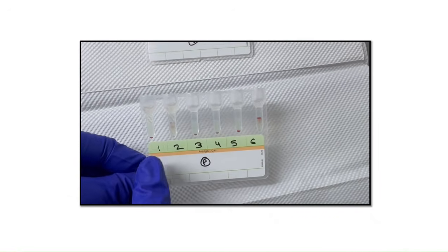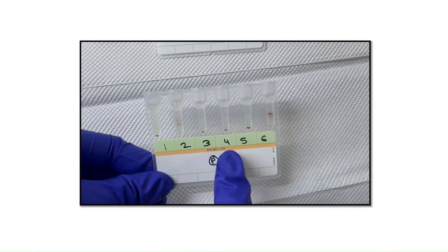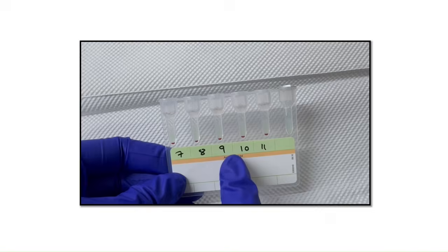So here we can see there is no reaction in first cell. Second, there is a reaction. Third, fourth, no reaction. Fifth, no reaction. Sixth, there is a 3+ reaction. Now in 7, 8, 9, 10th and 11, there is no reaction.